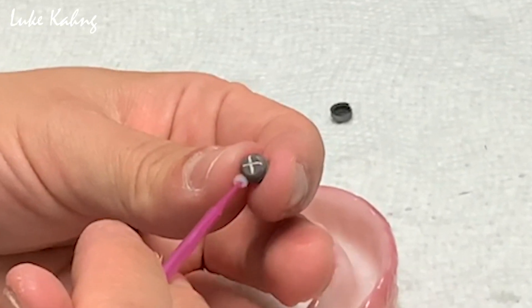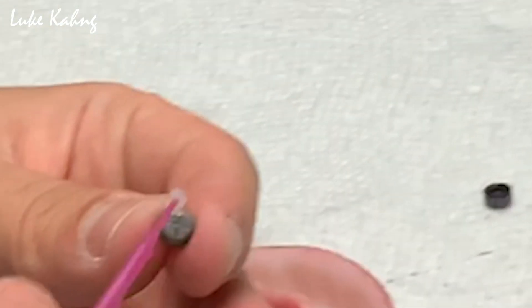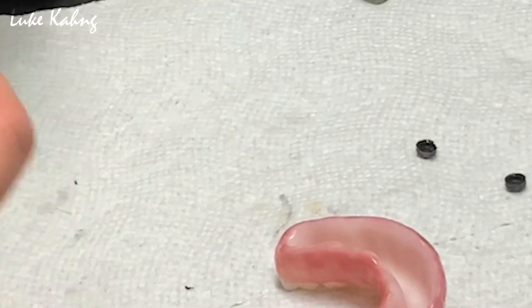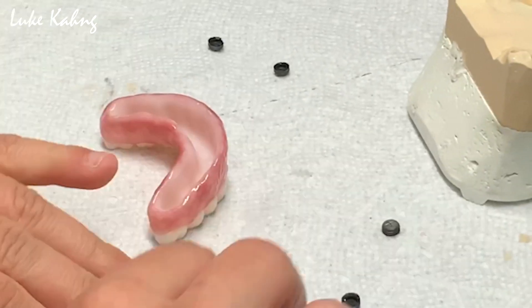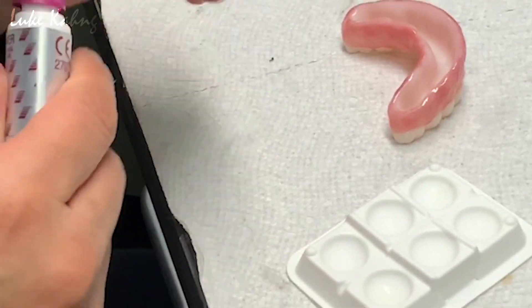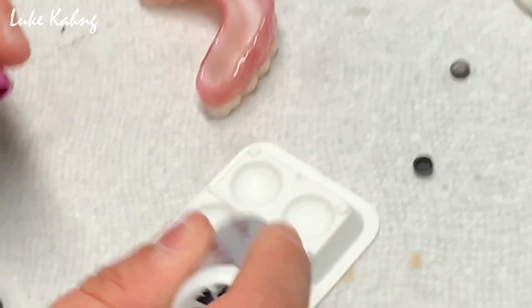In this video we go through the process of cementing a Cytin 5500 zirconia locator. For the cementing process, we use GC America Metal Primer Z and G Multi Primer, as well as Panavia A and B Paste.